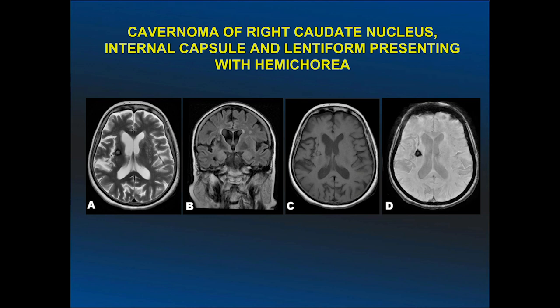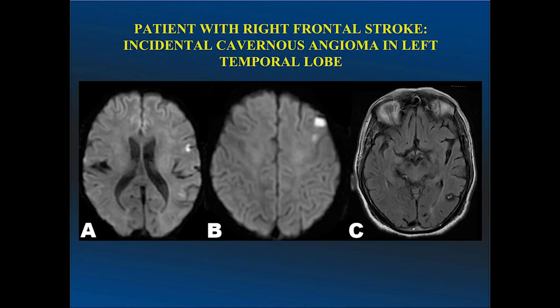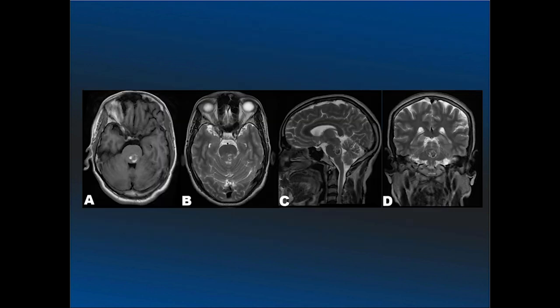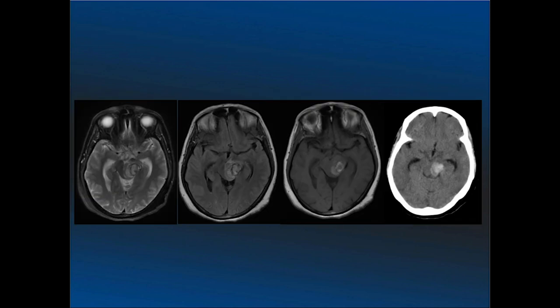Based on location, cavernomas can have different types of clinical presentations. This was an incidental cavernoma of the temporal lobe. This was a pontine cavernoma. You can see repeated stages of bleeding in cavernomas. This is a left midbrain cavernoma, also demonstrating repeated hemorrhages.